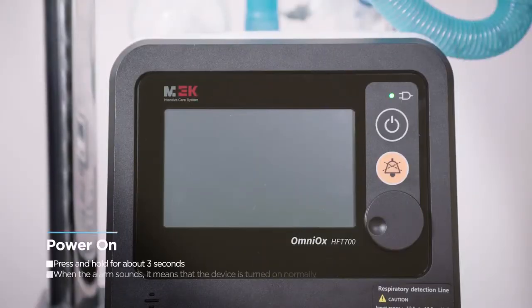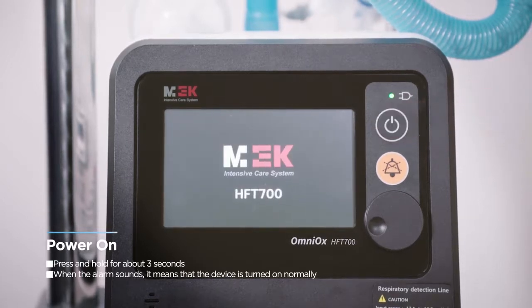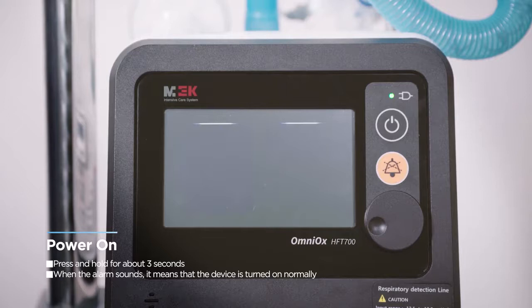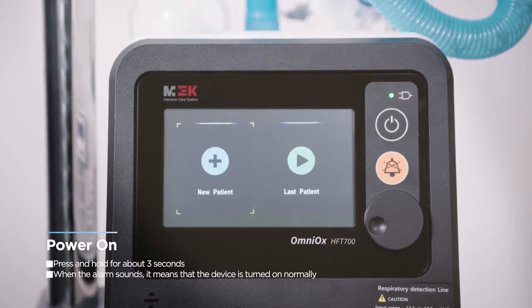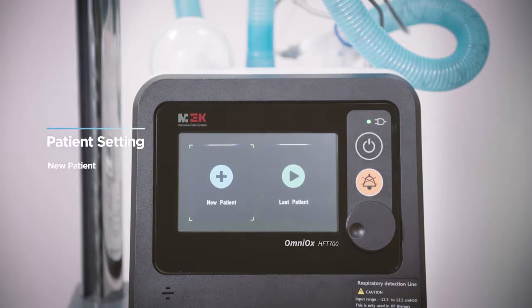Press the power button for about 3 seconds to turn on the device. The device will alarm with a single beep shortly. Software loading will appear on the screen and the system will complete loading at 100% within 10 seconds. On the first screen, you can select new patient or last patient. If a new patient connects a new circuit and uses a new size of cannula, select new patient.